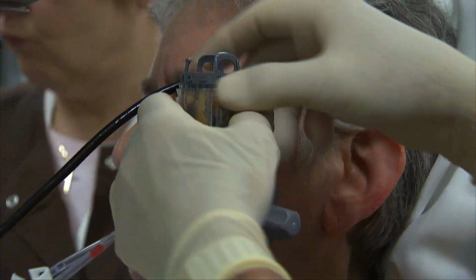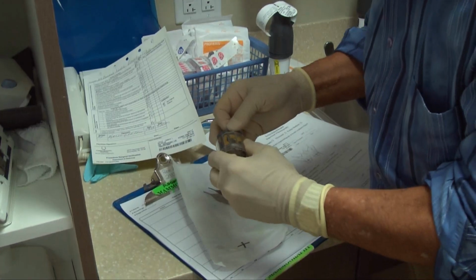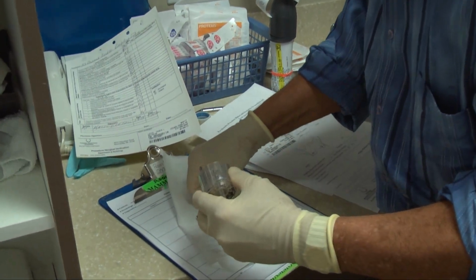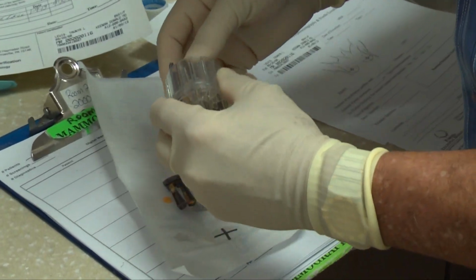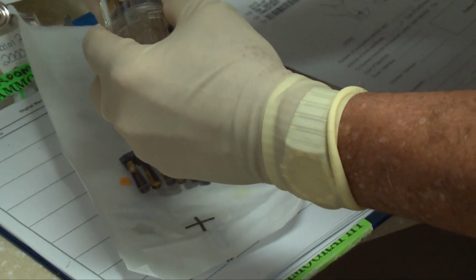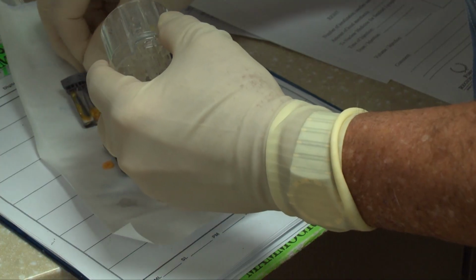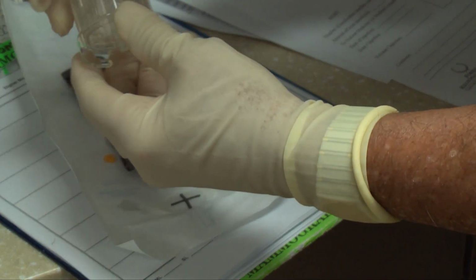Okay, the bowl's closed. I'm going to take off the top. Okay, so here we're going to take the samples out, and then we're just going to put it down here and flatten this out. The numbers are radio opaque, and where the specimen is radiolucent, so nothing is being hidden. So we're going to pull this out. Samples are coming out. Lost one, but we're going to put it down like that, and see there are no more samples in the slots, and now we're going to x-ray them.